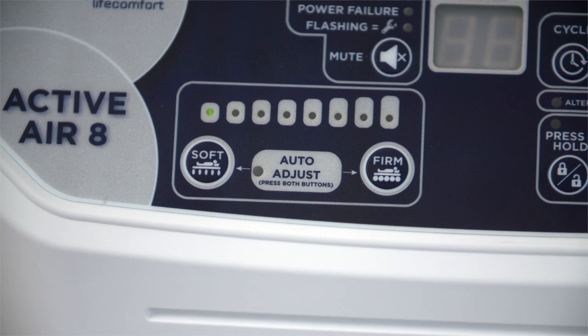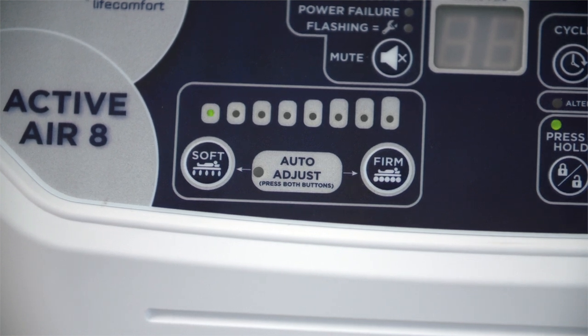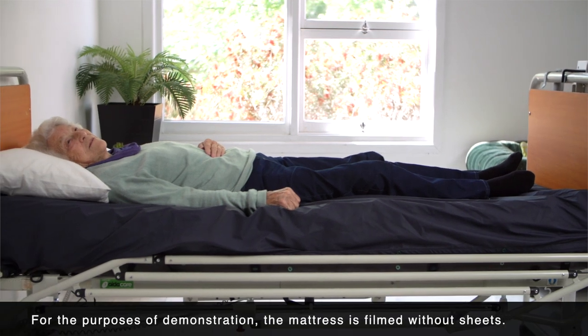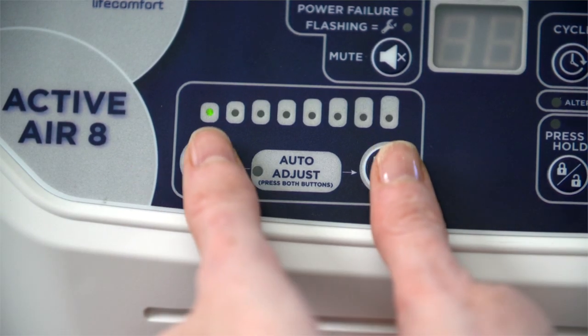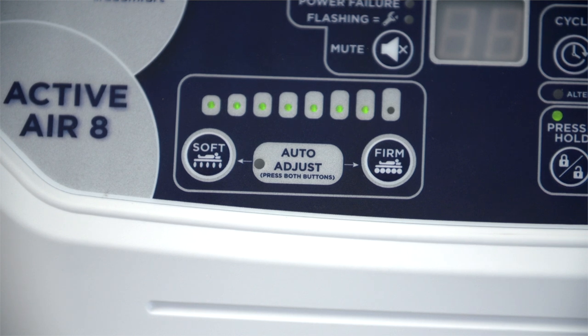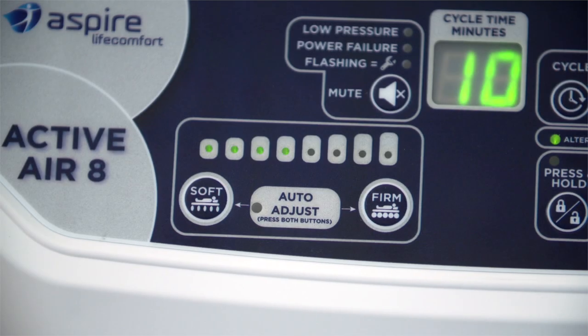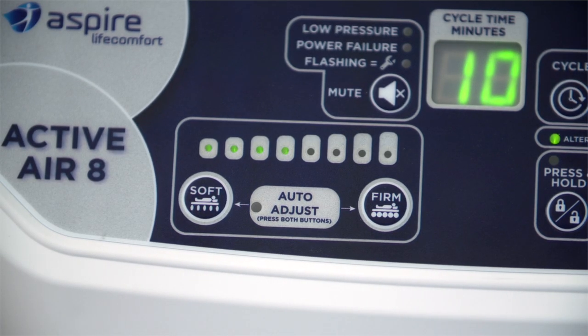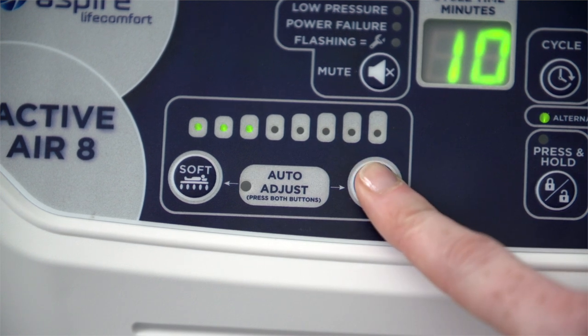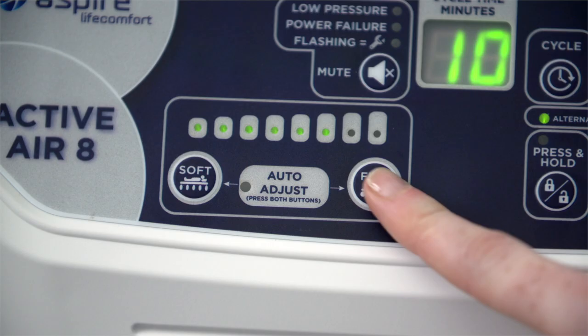When activated, the auto adjust feature will automatically set pressure output based on user weight. Simply lie the user on the fully inflated mattress, then press and hold both the soft and firm buttons at the same time. The LED light will start flashing, indicating that the mattress sensors are working to detect user body weight. After approximately 10 minutes, the LED light will stop flashing and the most appropriate settings will be automatically set. The Active Air 8 can also be manually set by adjusting the pressure according to the user's weight — your user manual can help guide you in this.